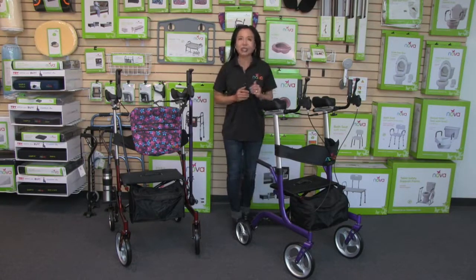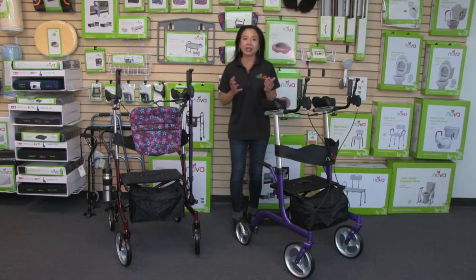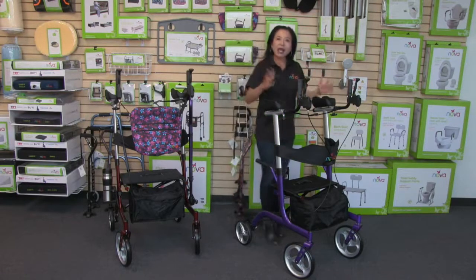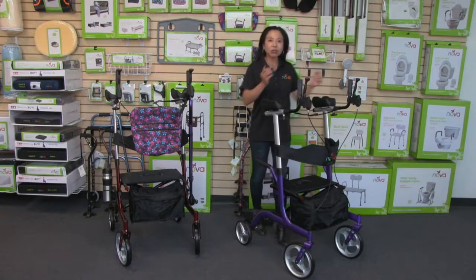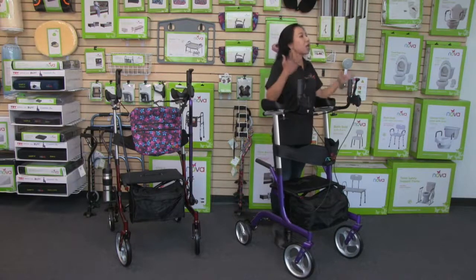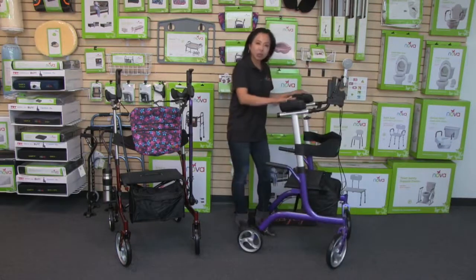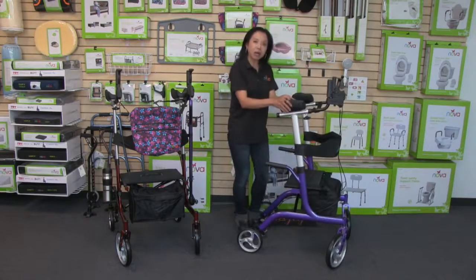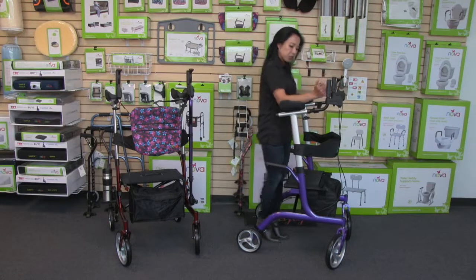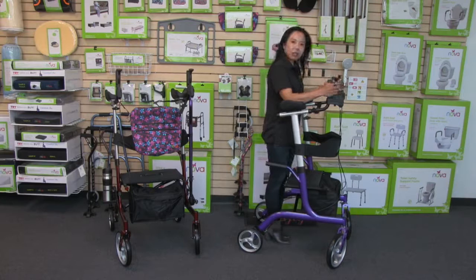The Phoenix Rise Up Rollator is our most powerful walker because it liberates your mobility, allowing you to rise up and look forward. It has a unique platform that allows you to rest your forearms, stand in an upright position, and look forward. This platform is contoured, durable, and very comfortable for your forearms, so you can rest your forearms, support your upper body, and put your hands on the handbrakes.